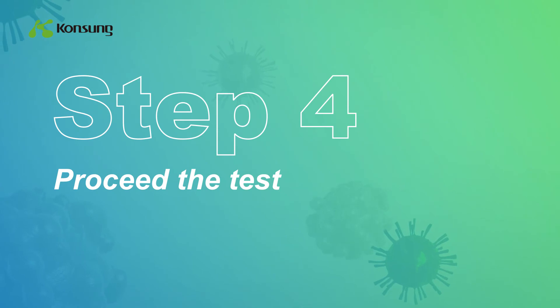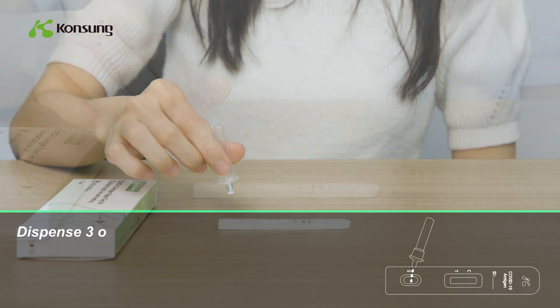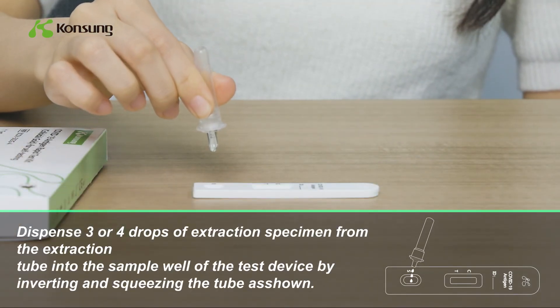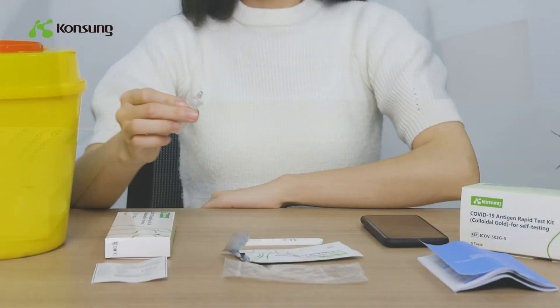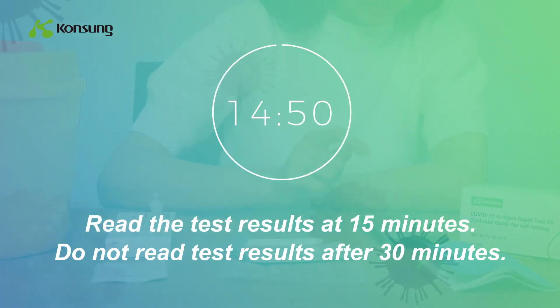Disperse 3 or 4 drops of extraction specimen from the extraction tube into the sample well of the test device by inverting and squeezing the tube. Read the test results at 15 minutes.